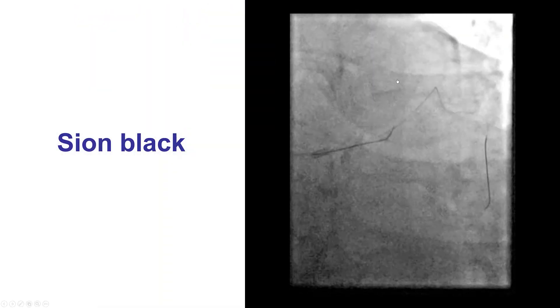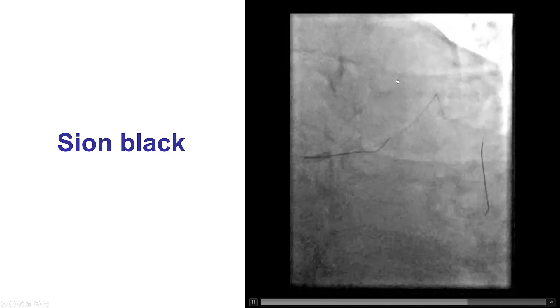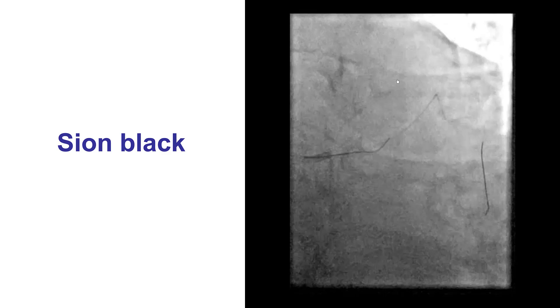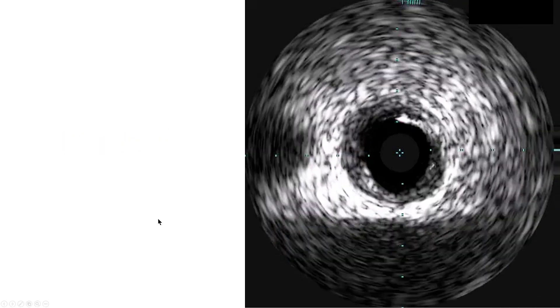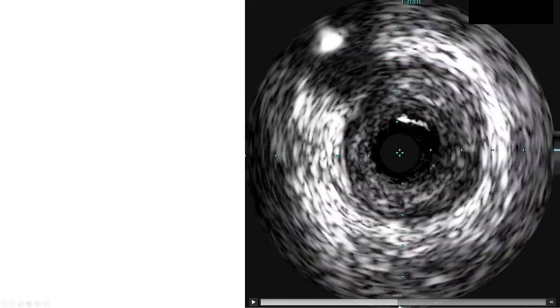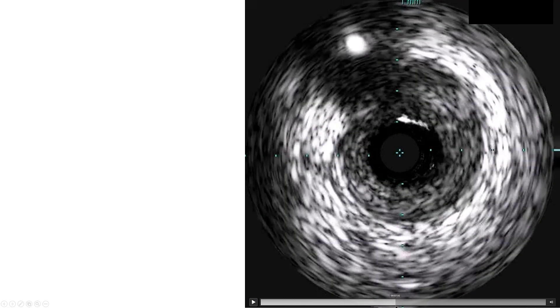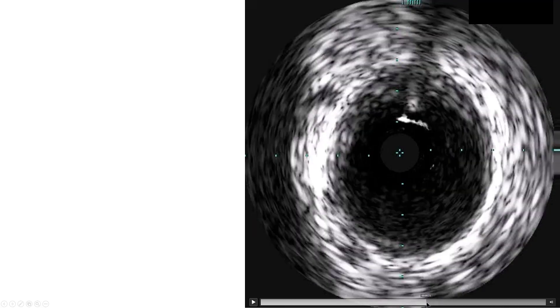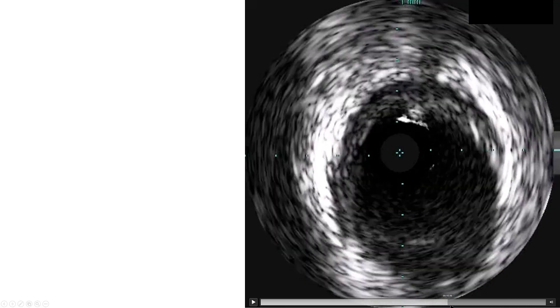Once we localized the origin of the vessel, we were able to advance a guide wire that seemed to course in the anticipated location of the vessel. However, to confirm 100%, we did intravascular ultrasound again. IVUS demonstrates that indeed the wire we used, the Sion Black, is within this vessel that has been occluded. So IVUS here was used both to identify the origin of the vessel, but also to confirm that the wire we placed actually went into that vessel.